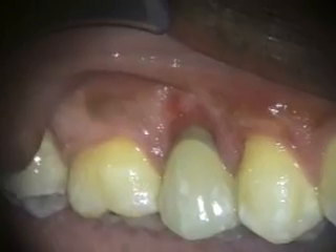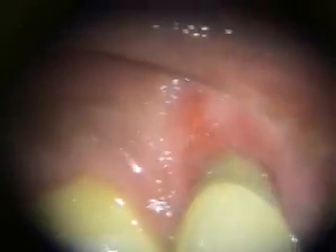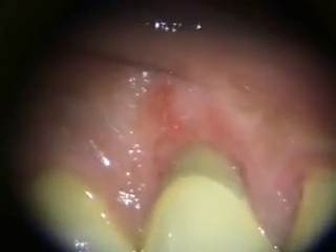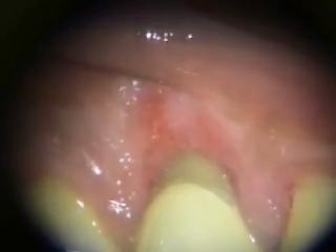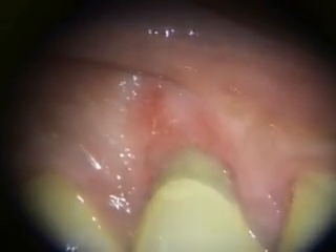This is a six-week healing now, and we're starting to get good ingrowth of the soft tissue into the graft, and it looks like it's all taking right there. I think I'm going to take a look at this in about a month.